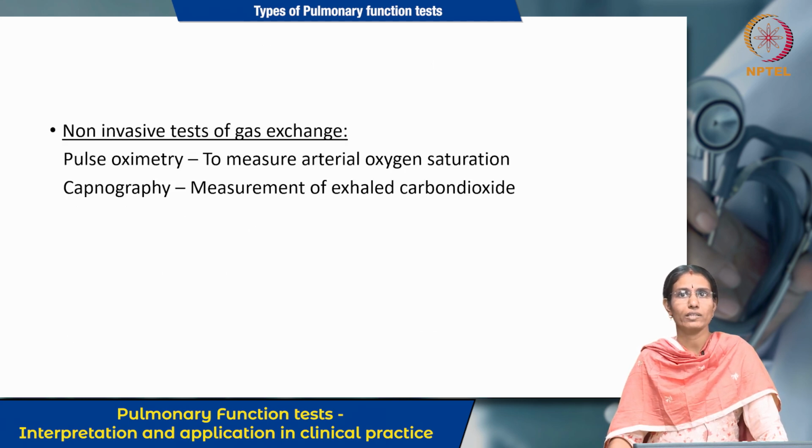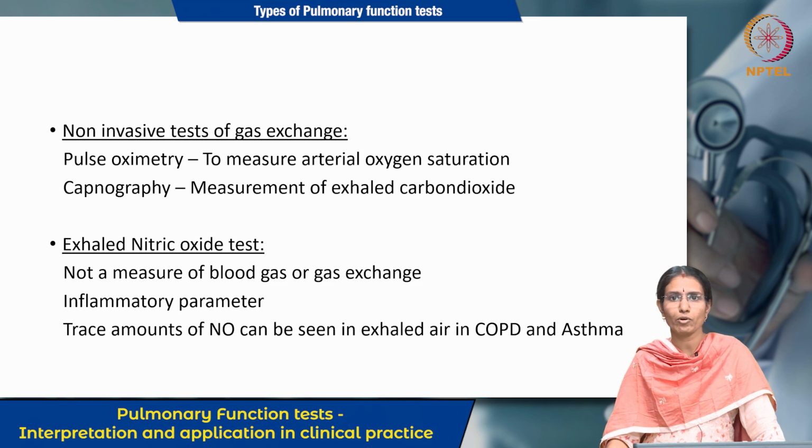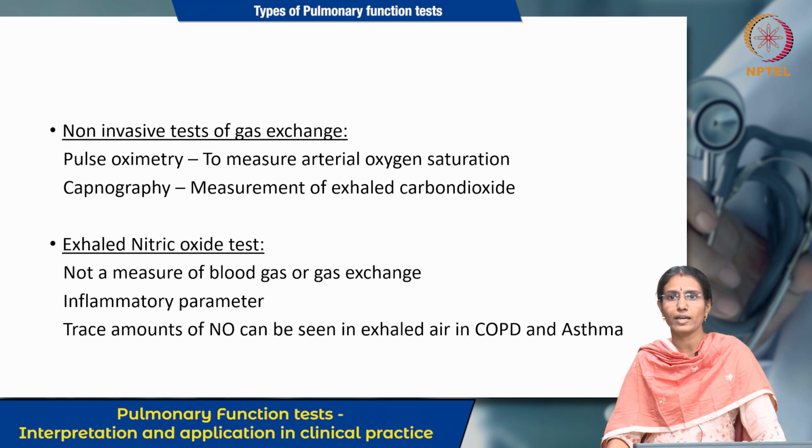Yes, there are some non-invasive tests like pulse oximetry to measure the arterial oxygen saturation, and capnography to measure the exhaled carbon dioxide. And because we have done the measurement of exhaled carbon dioxide, let me also talk about another pulmonary function test called the exhaled nitric oxide test. This is strictly not a test of gas exchange, but an inflammatory parameter. Trace amounts of nitric oxide seen in the exhaled air indicate inflammatory conditions like COPD and asthma. So hence this is also an important pulmonary function test which is being done.